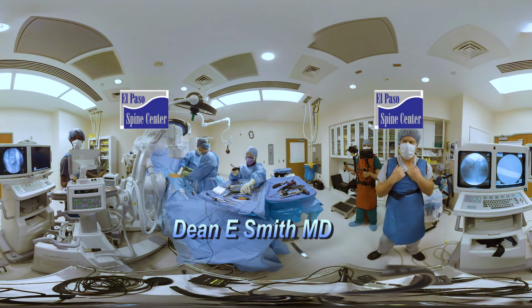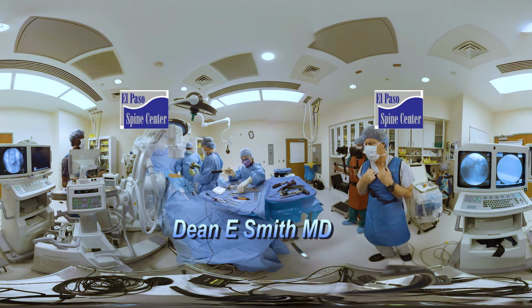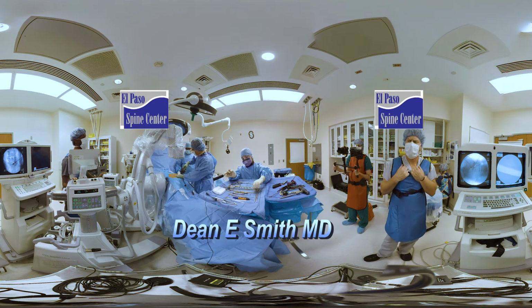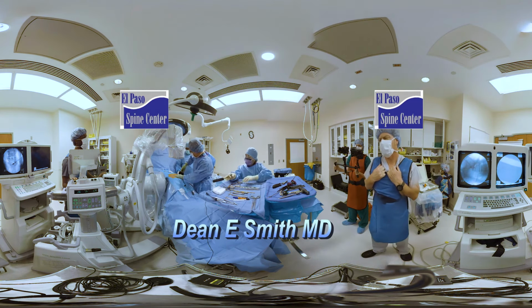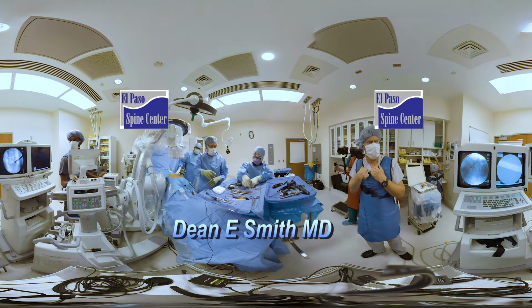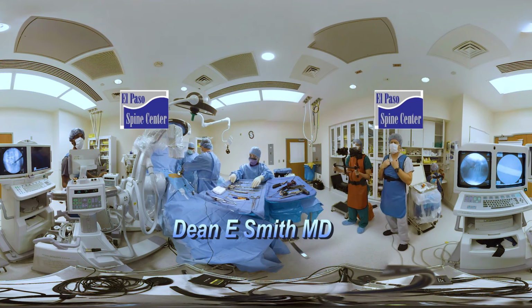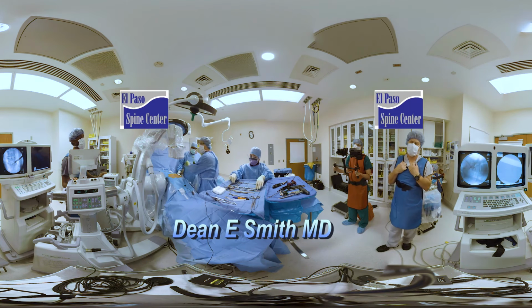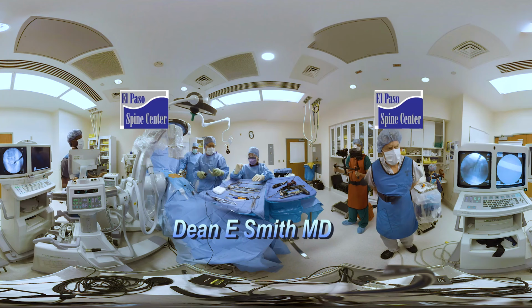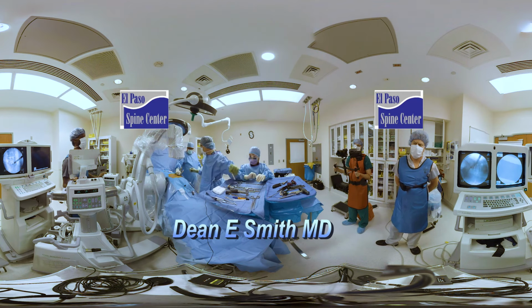I like it. And then this. AP. Yeah, there it is. Okay, need this and this. AP. Lateral. That's probably good. I'm going to take that out. So I need this one.